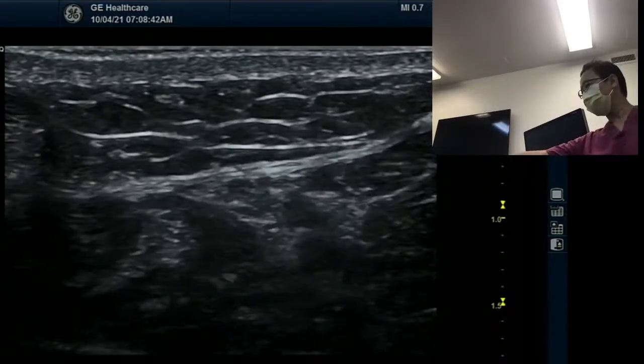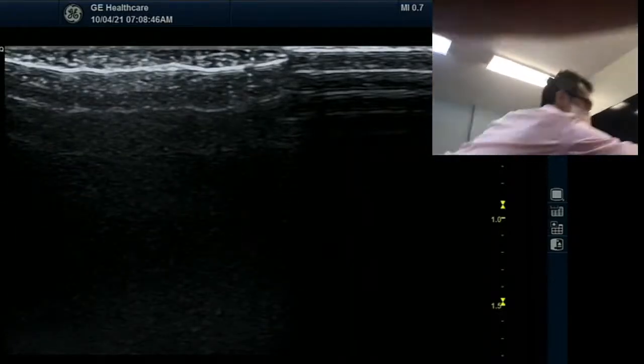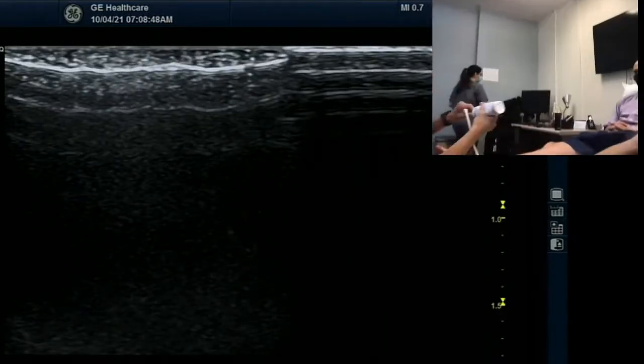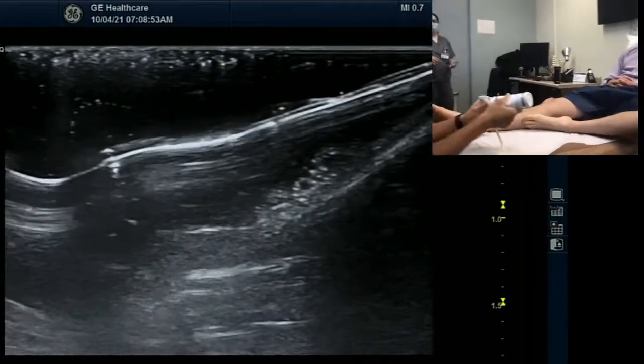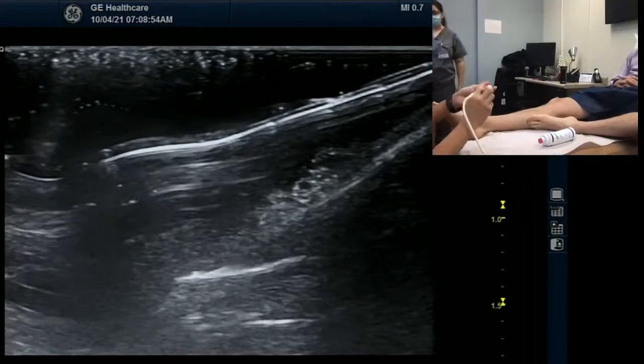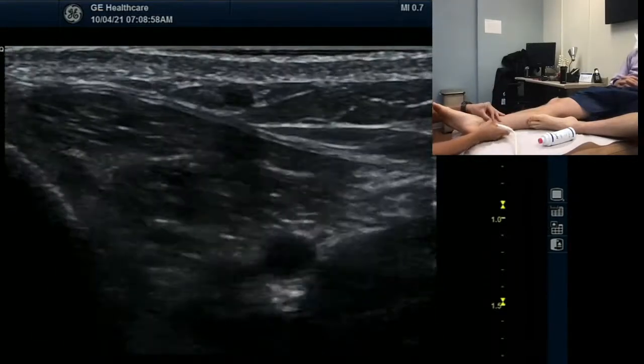Can you look kindly to the other light? You want the right light? So we can show to people. Because I think when we did the plantar nerve, it was good. You will scan from the other side and you were able to see. I'm going to start at the medial ankle.